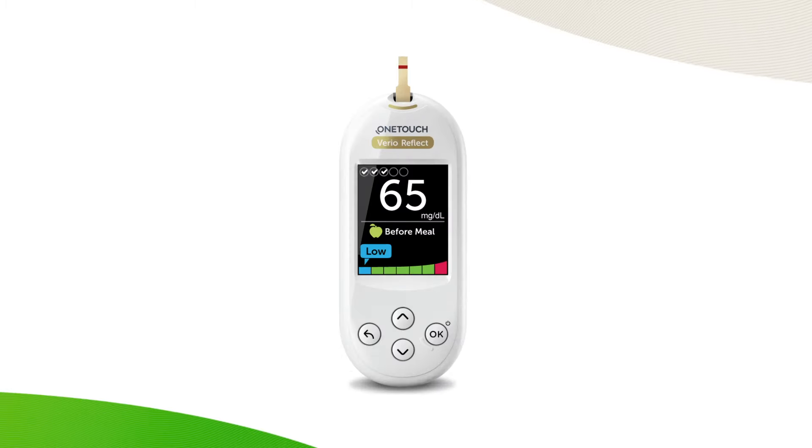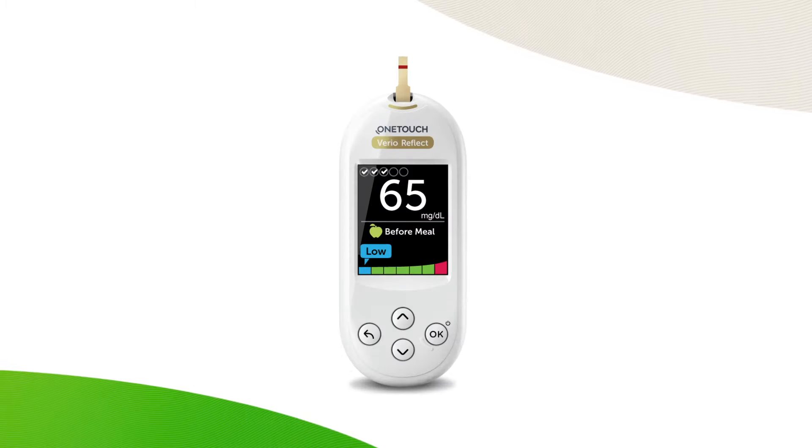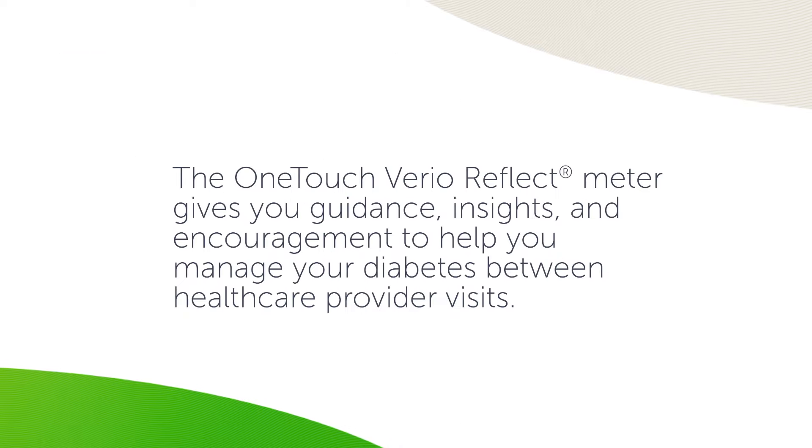If you are looking for a more personalized experience, the OneTouch VarioReflect meter may be the right meter for you. Let's take a closer look at the OneTouch VarioReflect meter. This meter gives you guidance, insights, and encouragement to help you manage your diabetes between healthcare provider visits.